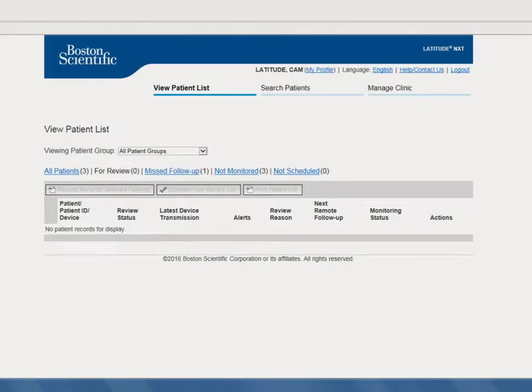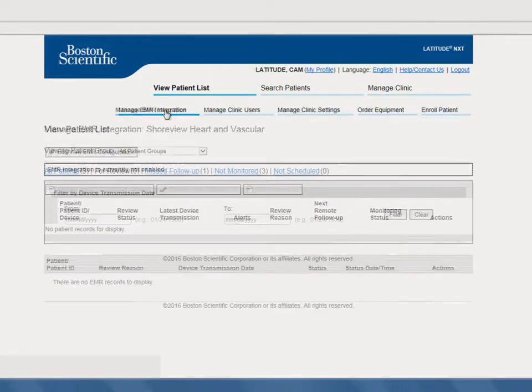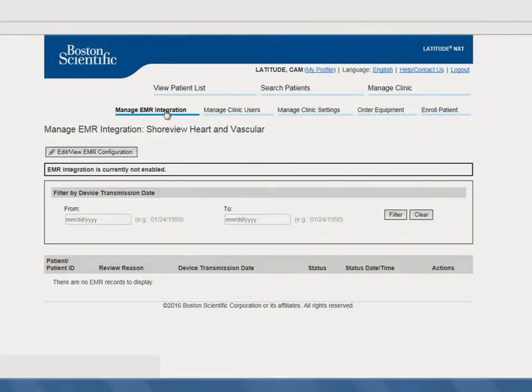To configure, hover over Manage Clinic and click Manage EMR Integration. Next, click Edit View EMR Configuration.